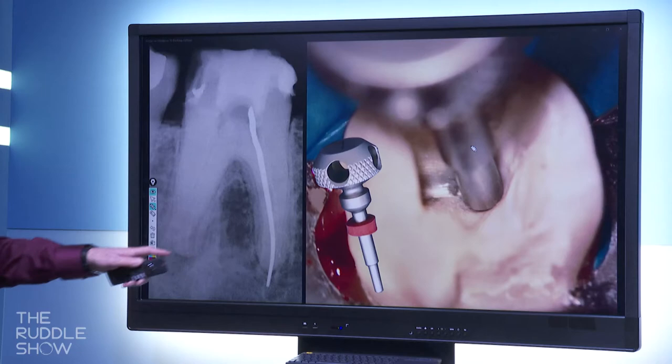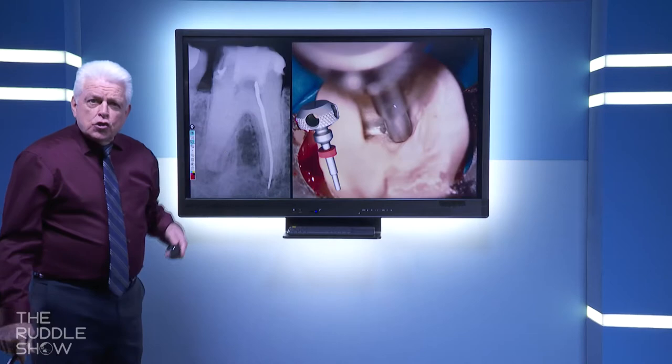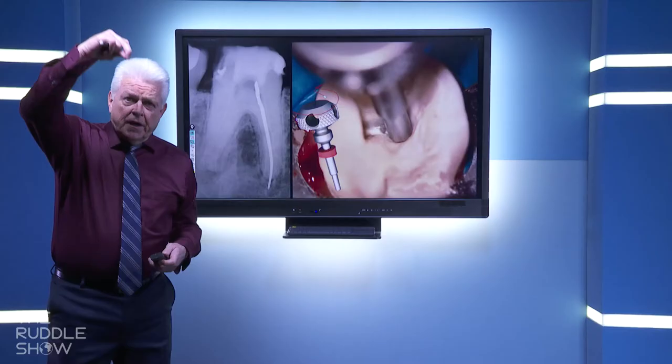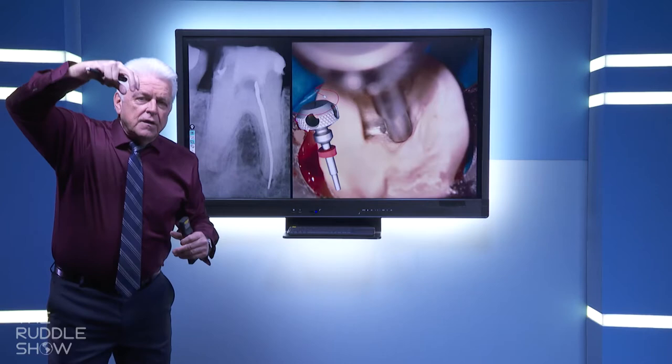Now, because it's about 7 or 8 tenths of a millimeter, I can bring in the number one tubular tap. And remember, it turns counterclockwise. You will then engage with its distal end, the silver point. You can either pull straight up or you can use the extracting plier and in a very controlled way, jack that silver point out of there. How about that?